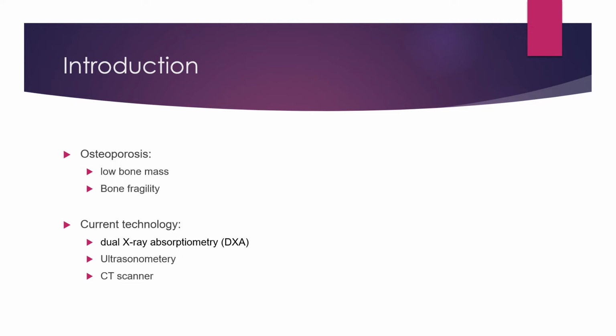In current technology, the devices used to measure bone mineral density, or BMD, are dual X-ray absorptiometry, or DXA, ultrasonic bone densitometry, now known as ultrasonometry, and a software application for CT scanner.